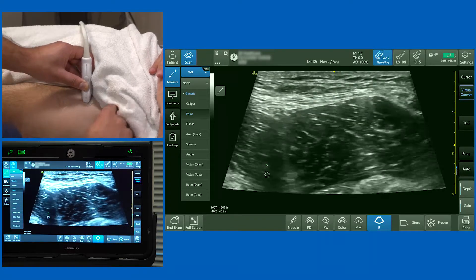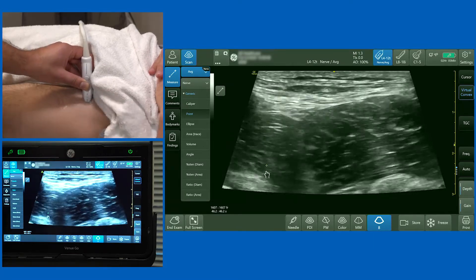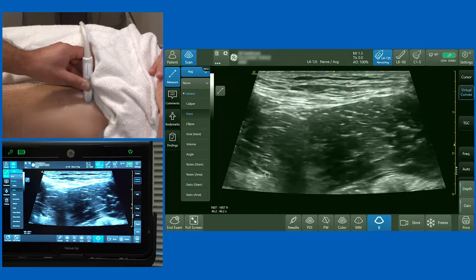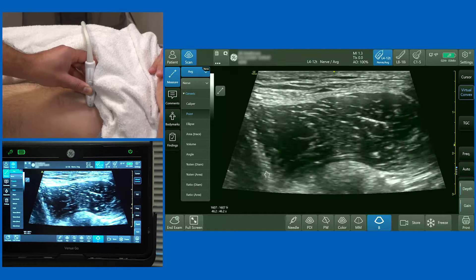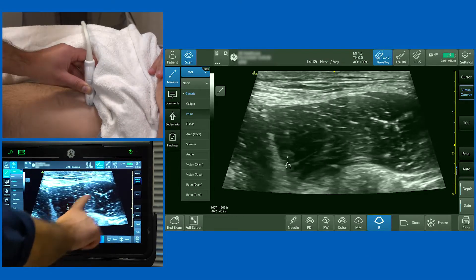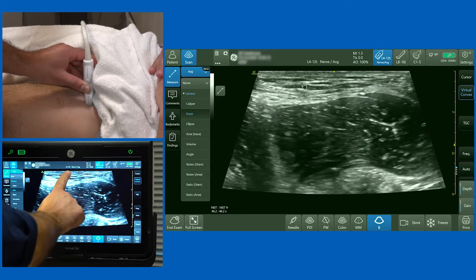I'm using a high-frequency linear probe. To orientate yourself, this is the anterior superior iliac spine. I'm placing the probe directly just above the inguinal crease. As I slide laterally, you'll see a large bulk of muscle — this bulk of muscle on the screen is the iliopsoas muscle.